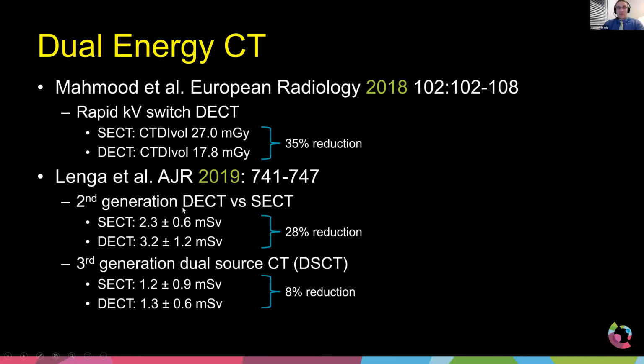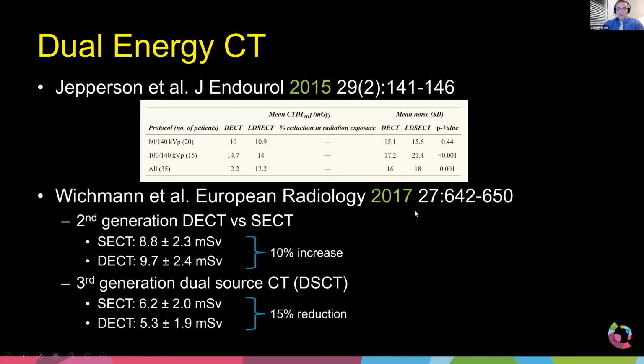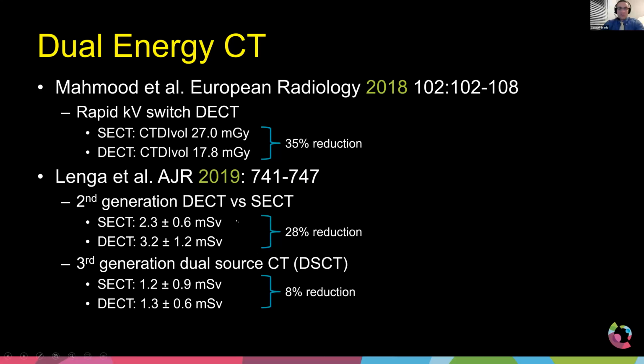Now, a couple of things to point out. From 2017 with the second generation, the dose is actually higher for the dual energy. Sorry, won't go forward.